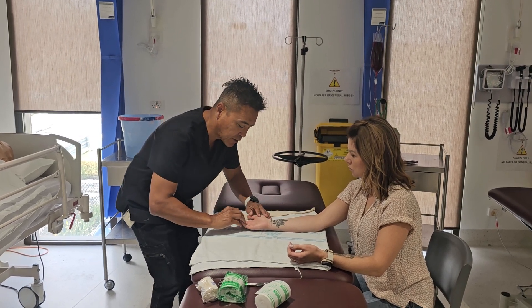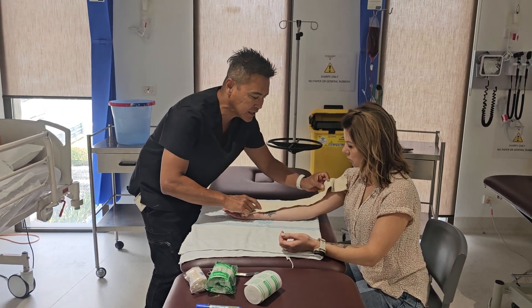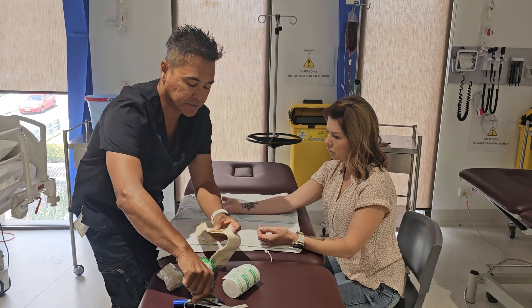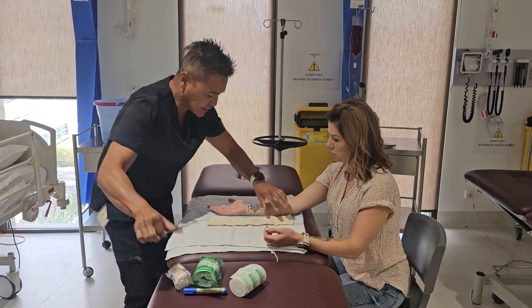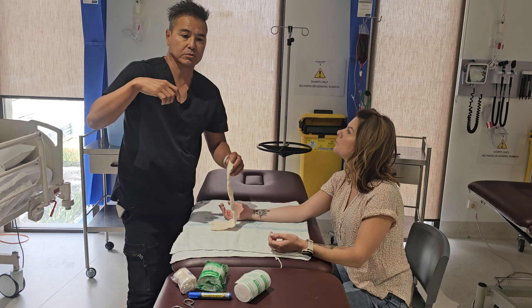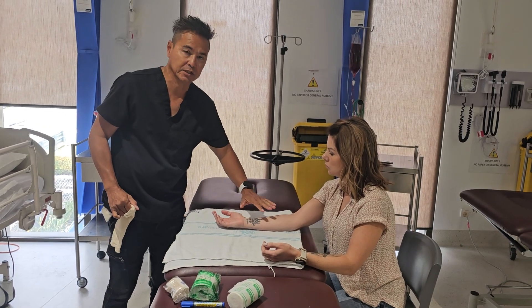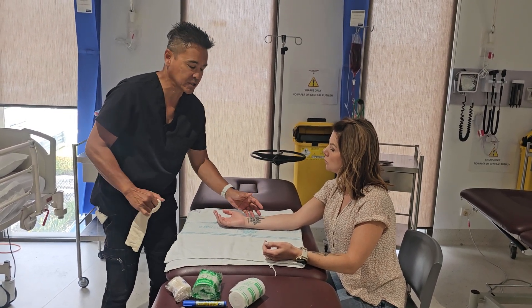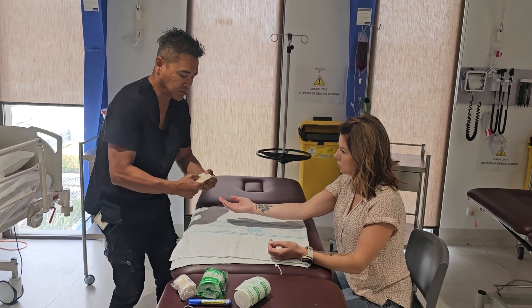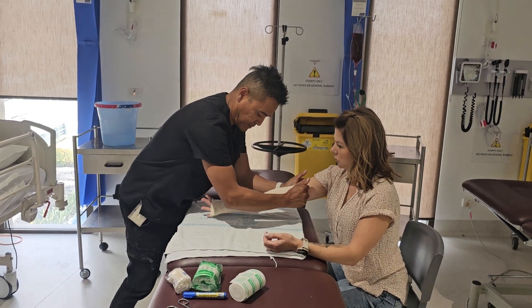We want to measure from where the crease of the hand is to about mid-bicep, and we'll custom make this up to about there. We're also going to cut a little circle where Rachel's thumb is going to go. Don't make the circle too large — if it's too small we can just work the thumb around it. The patient is able to help by running their fingers through the stockinette as we go.